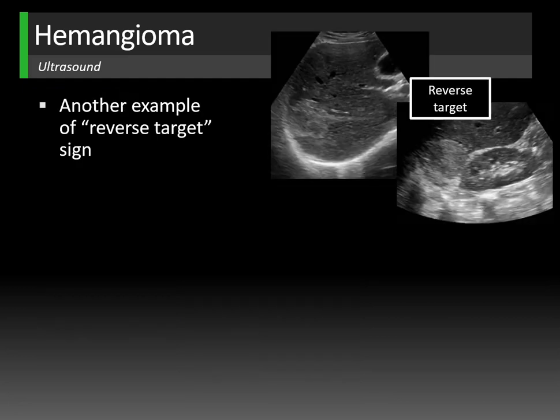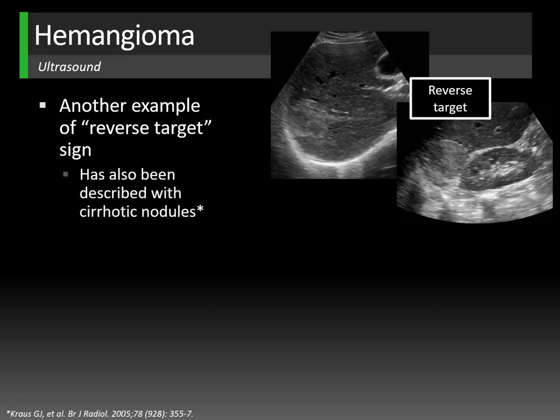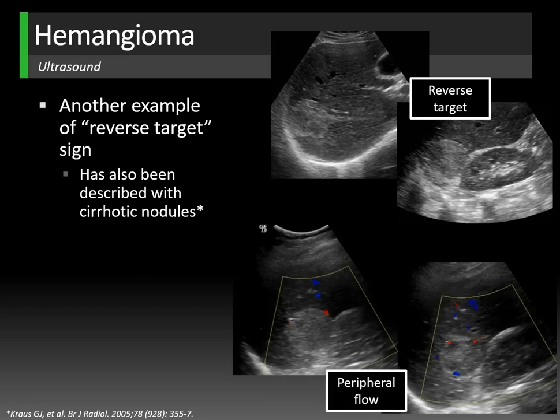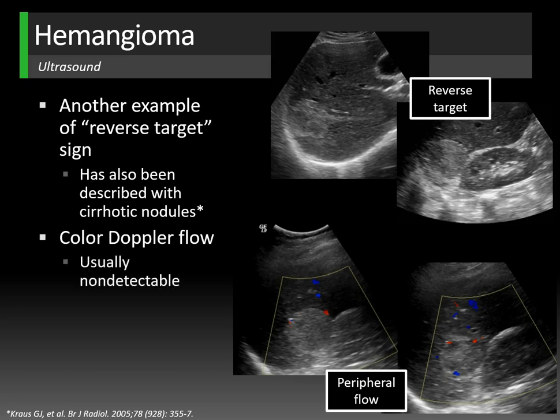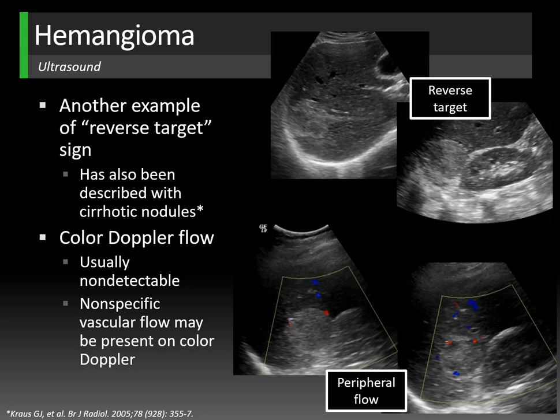Here's another example of the reverse target appearance — echogenic periphery and centrally isoechoic or hypoechoic. Hemangiomas can be a little heterogeneous as well. The reverse target appearance is not specific for hemangioma; case reports describe it with cirrhotic nodules and benign multifocal nodular steatosis, and rarely with malignancy. Occasionally peripheral color Doppler flow may be seen in hemangiomas — this nonspecific vascular flow should not dissuade you from a diagnosis of hemangioma.